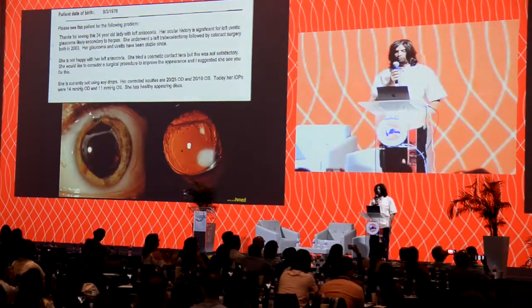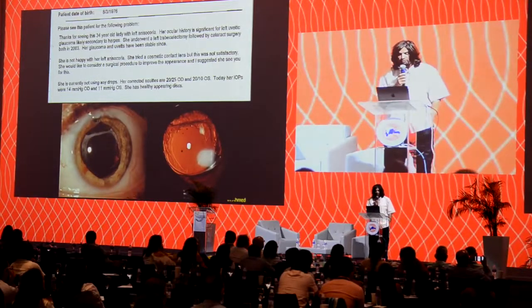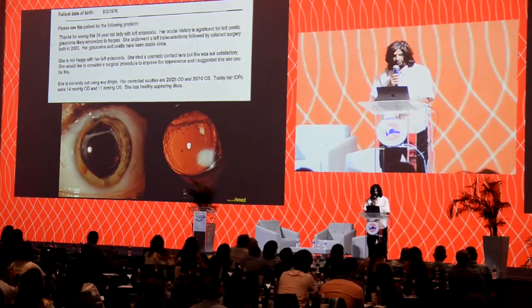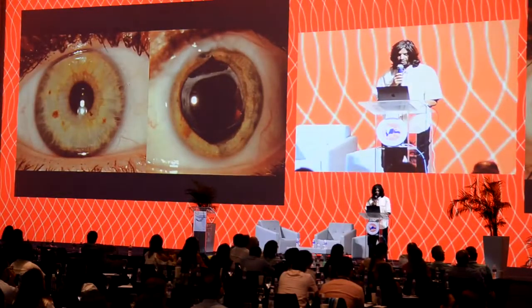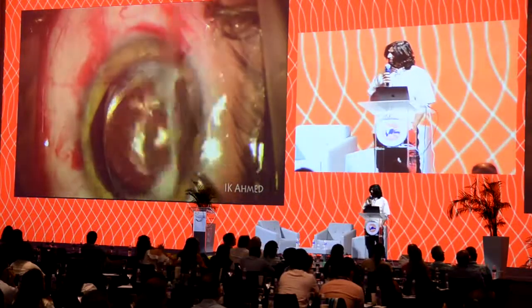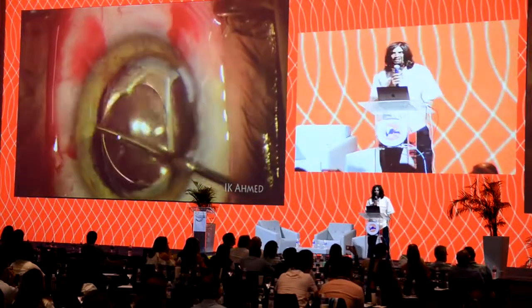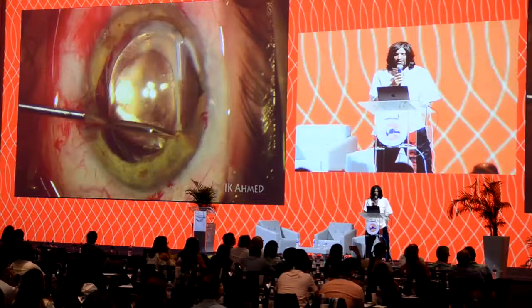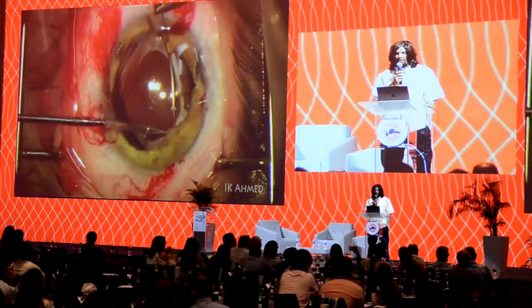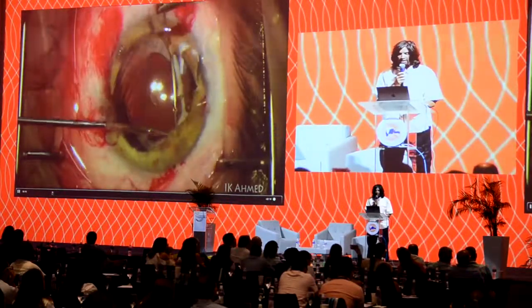This was a patient referred to me, a 34-year-old who had a previous trabeculectomy with a remaining atonic pupil, pseudophakic, very bothered by the appearance and by the photophobia. This is the right and left eye here. There's her bleb. I want to, of course, avoid manipulating the bleb. And it's amazing, even after many years, the iris, as long as there's no synechia or atrophy, can be quite readily manipulated. It's quite elastic and spongy. And of course, there is some risk of iridodialysis and bleeding, but it's actually quite uncommon in our hands.